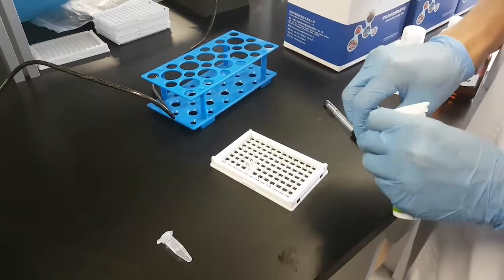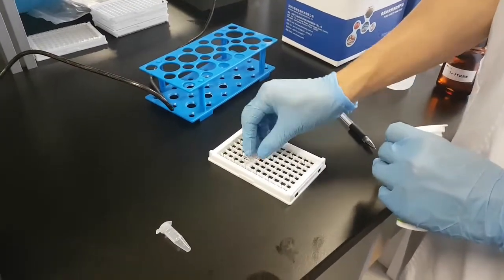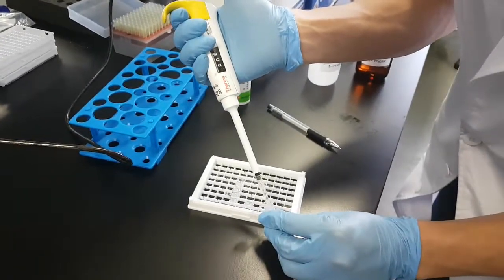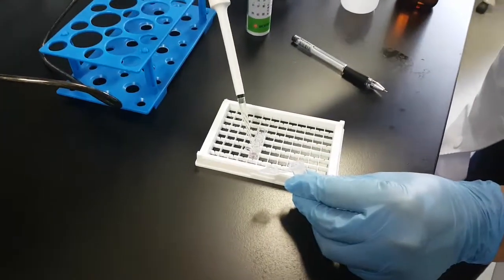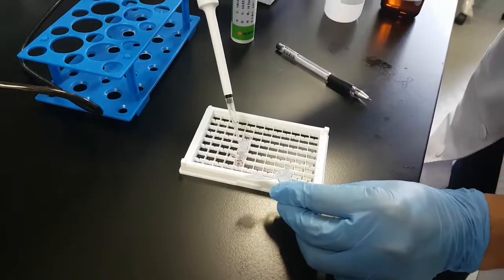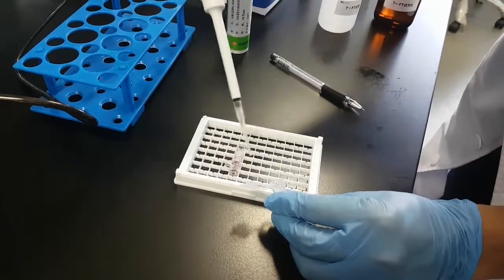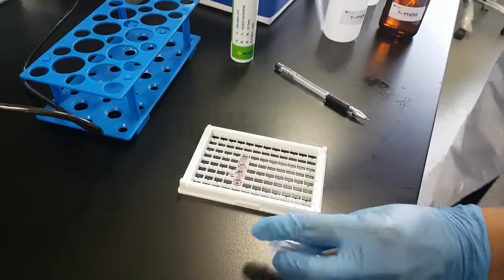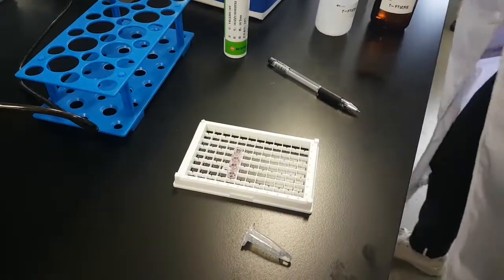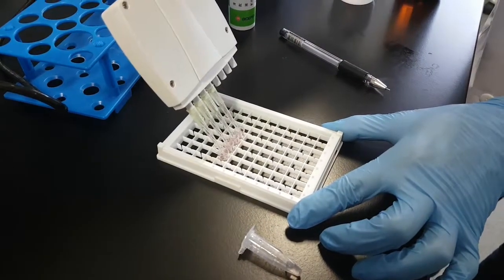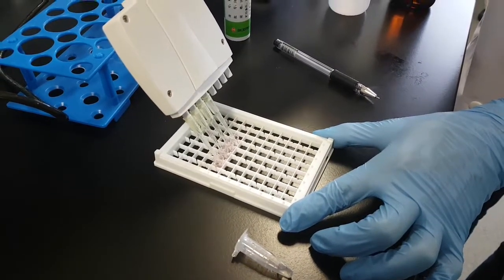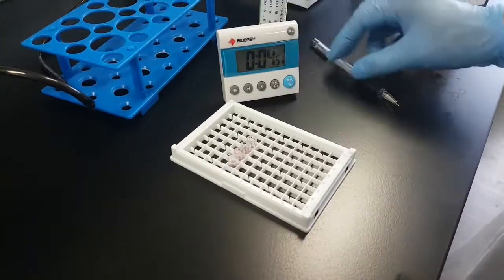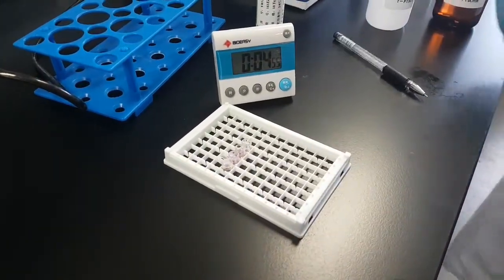Now next step will be testing. Take the number of microwells you need. Take 200 microliters of the detection sample and put it into the red microwells, 200 microliters to each red microwell. Mix well for 5 to 10 times. Incubate for 5 minutes, that will be our first incubation.